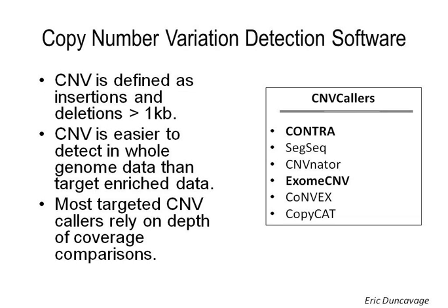So there are lots of different tools available. We have tested different bioinformatic tools shown here, Contra and ExomeCNV and CopyCat, which was developed at WashU by our lab. So we have been testing all the different copy number variation tools on the NGS data to see if we are missing any clinically relevant or actionable copy number changes.